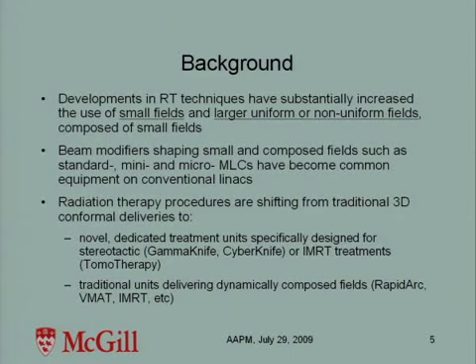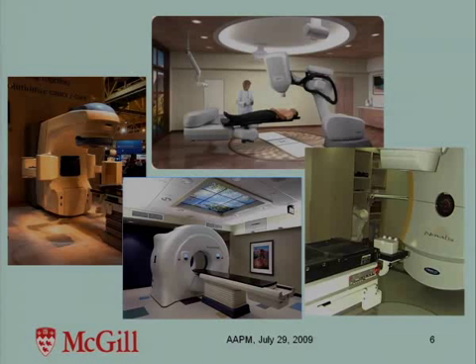The radiotherapy procedures have become much more developed in the sense of novel dedicated treatments using, for example, tomotherapy, CyberKnife, or Gamma Knife, or IMRT treatments that are carried out on traditional accelerators, such as RapidArc or VMAT, such techniques. So here are some of the hardware for tomotherapy, CyberKnife, and the machines that deliver VMAT and RapidArc.